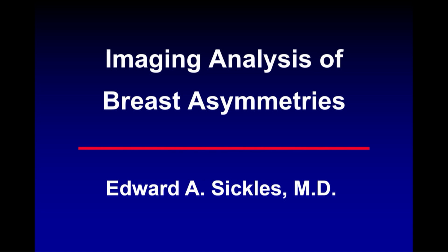And it's also becoming, over time, oh, I should show you this slide. It is becoming over time with screening mammography the way that we are finding more and more early breast cancers. We're finding them before they become masses. And that's why this is so important. It's also important because asymmetry as a whole category, almost all of them are benign. So how do we pick out the small percentage? It's only about 1% that turn out to be breast cancer.